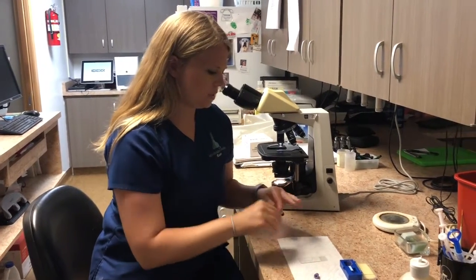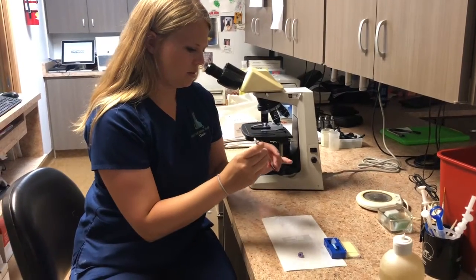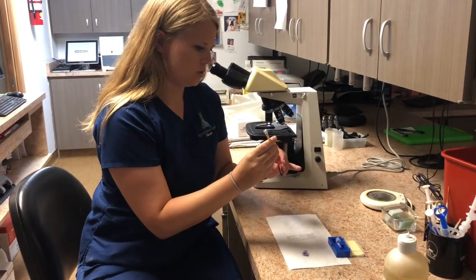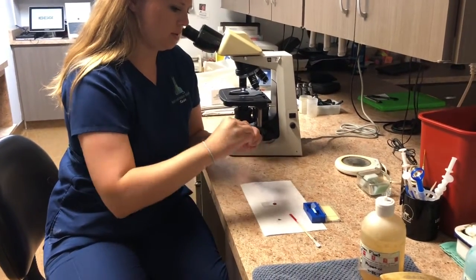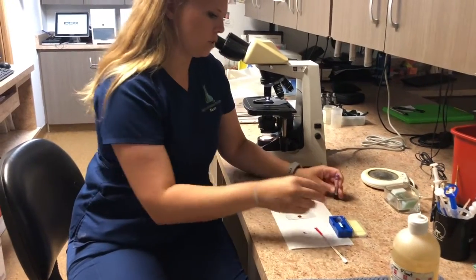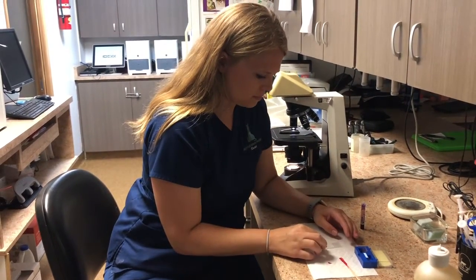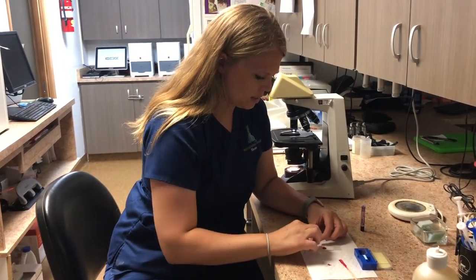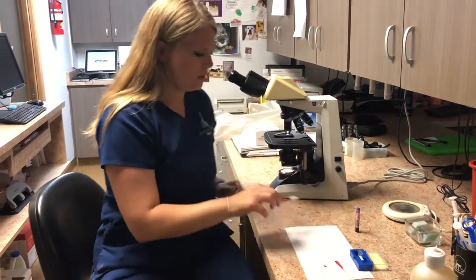Use my 2 applicators to get a drop of blood on my microscope slide. I'm going to place a cover slip directly over top.